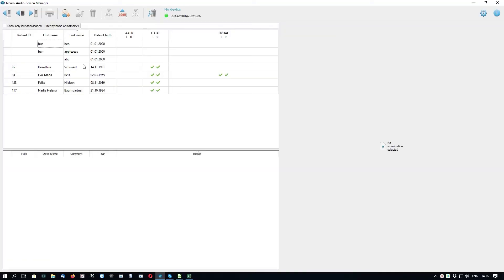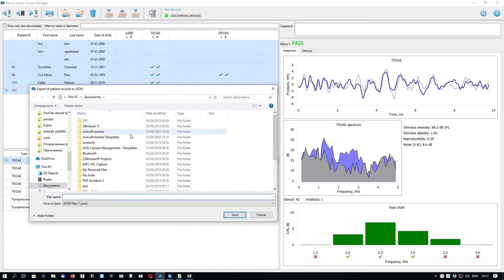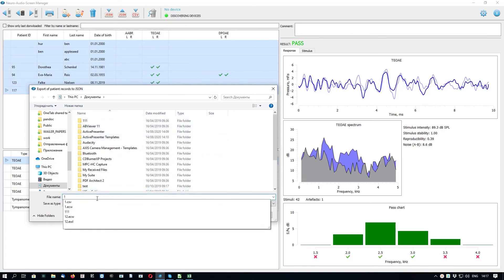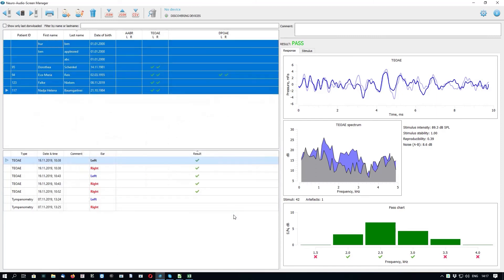To transfer data from this PC to another computer, you can export it to a JSON file — a plain text format. First, select the patients you want to export; for example, select all using Control+A on the keyboard. Then click the Export to JSON button, enter a file name, and click Save. On another computer, click the Import from JSON button to import the data from this JSON file.